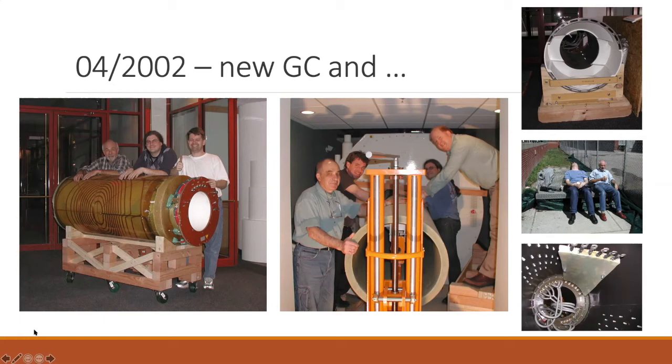So it was a fiberglass shell filled with epoxy resin, and we wanted to make sure that the coils can't move in the magnetic field. There would be strong forces on the coils, and we wanted to avoid that, so that we don't have any cables breaking if they constantly move. What we didn't consider, though, is that the resin, if the cables get hot, gets soft again. No?